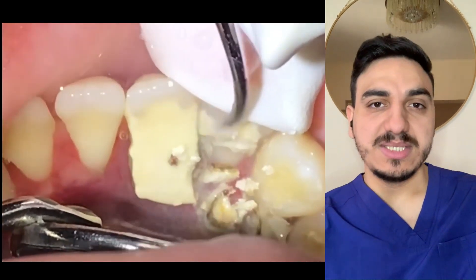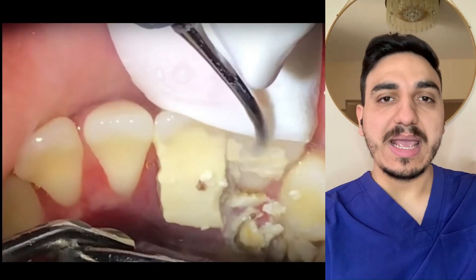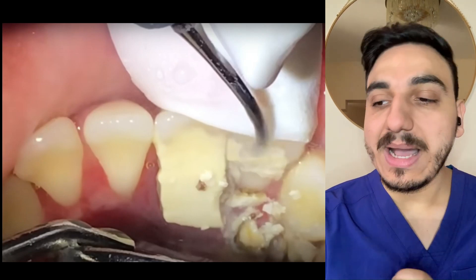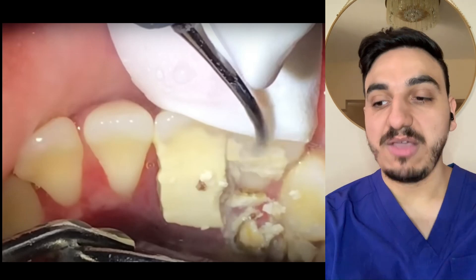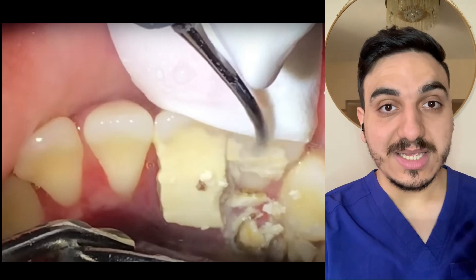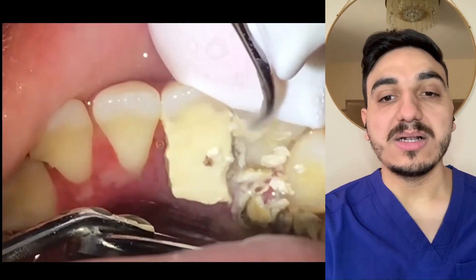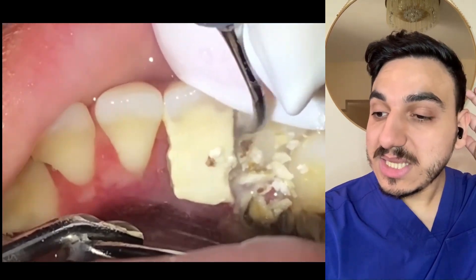As you can see, we don't just do one tick and the whole thing is removed. We need to remove it gradually, especially if it's something huge like this, and to ensure that there are not that many calculus or dental tartar deposits remaining.